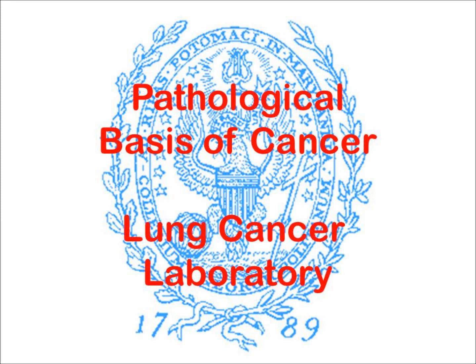In this two-part video, I will describe the individual slides of bronchiogenic carcinomas. Now, remember that these tumors originate from the epithelium lining the respiratory tree and represent the vast majority of lung cancers, but it excludes such things as mesotheliomas that arise from the outside linings of the lungs and metastases of other cancers to the lungs.